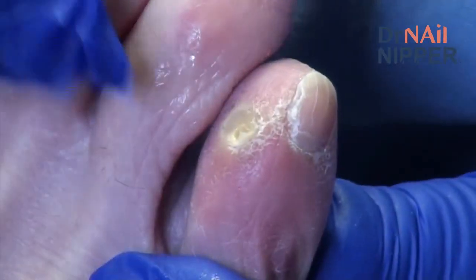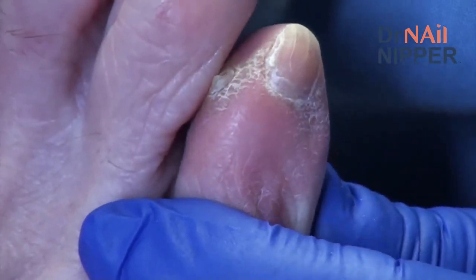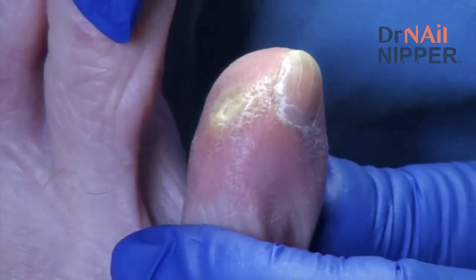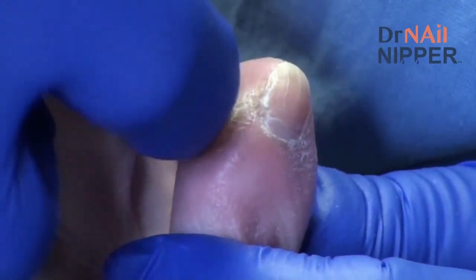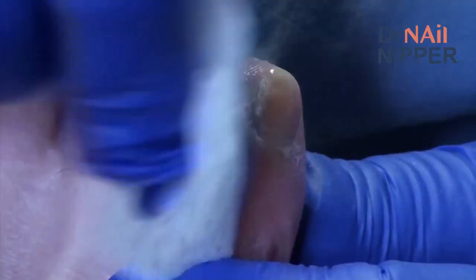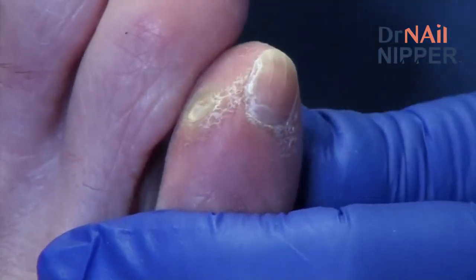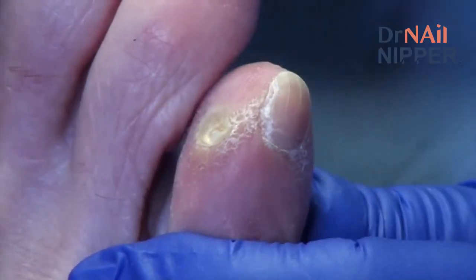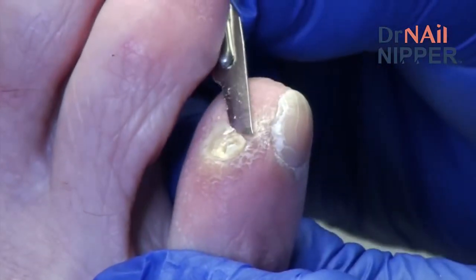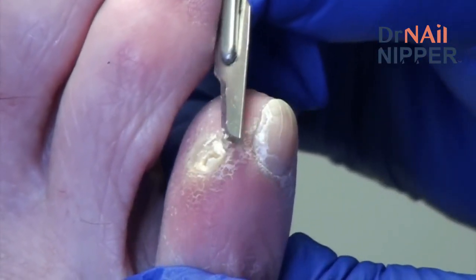So this is a corn that is on the inside of that baby toe and it comes because the bone right underneath there is hitting up against the other bone in the other toe. Sometimes people have a corresponding corn right there, but you just have this one. The fact that it's been so painful makes me wonder if there's maybe an open sore underneath it. So let's trim everything down here and see if we can get the thick skin off and make sure that the skin underneath is good.